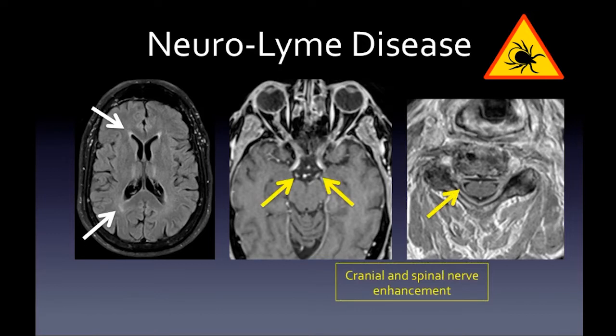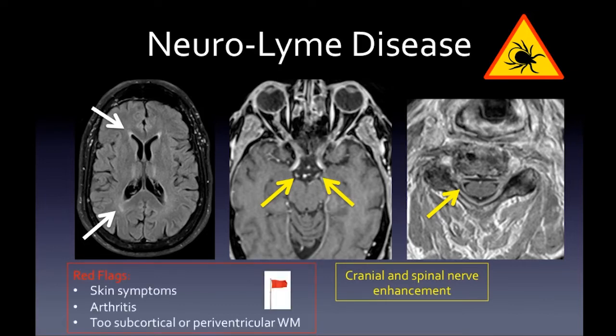Lyme disease is rare to see with MRI findings. It's a spirochete disease from Borrelia and can produce periventricular and deep white matter lesions. Key clues: cranial and spinal nerve enhancement. Red flags: classic skin rash and arthritis. The FLAIR lesions are usually very subcortical or periventricular without infratentorial or cortical/juxtacortical lesions typical of MS. Cranial nerve — such as ocular motor nerve — and spinal nerve enhancement should point you away from MS.